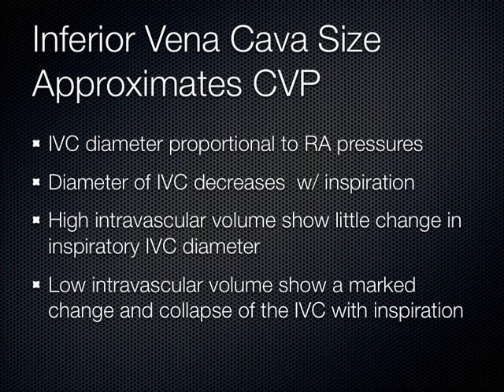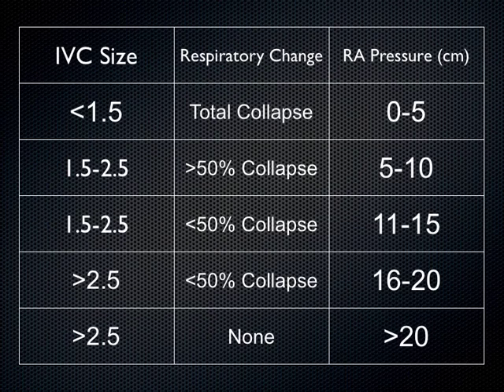And that's especially true when you have patients who are in shock, like septic shock. And so that's where this all will play in for you later in your clinical years. But I just want to give you that preamble right now, that you can actually estimate the right atrial pressure non-invasively by looking at the diameter of the IVC and how it collapses during inspiration. So if the IVC is really, really small and you breathe in, it collapses down, then your right atrial pressure is really low and you need some fluids.